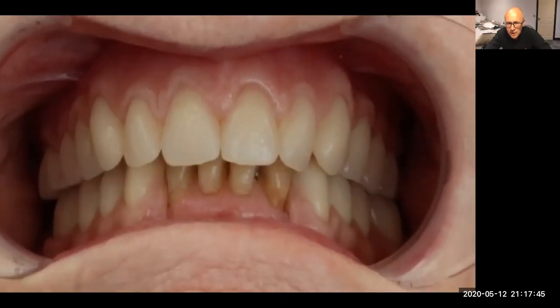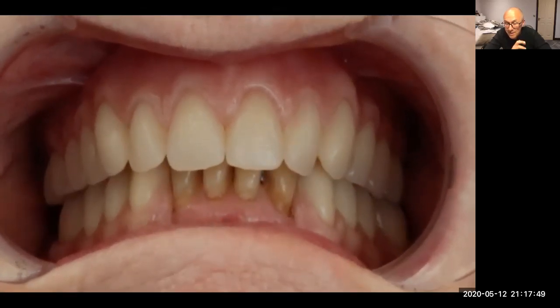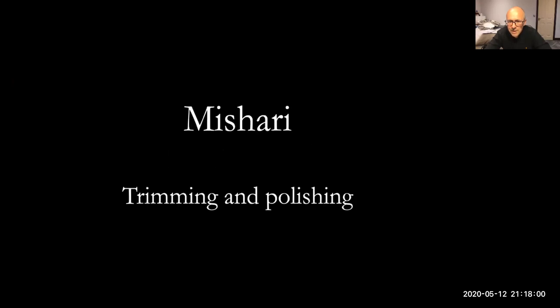In an NHS practice, where the dentures are really very good and the teeth are really soft, tap together. This works really quickly. It works a treat. It takes longer with these really good teeth.